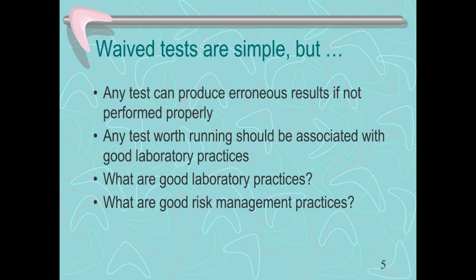Waived tests are fairly simple to do. Anyone can learn them, but there's some things we have to think about. Any test, if it's not done appropriately, can give false results. It can give a false positive or a false negative.